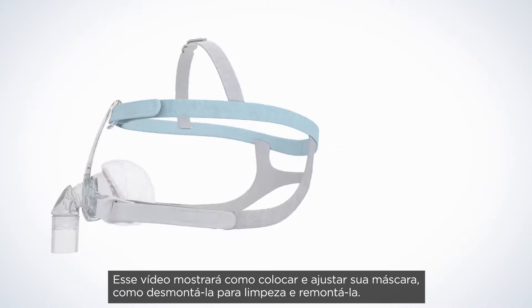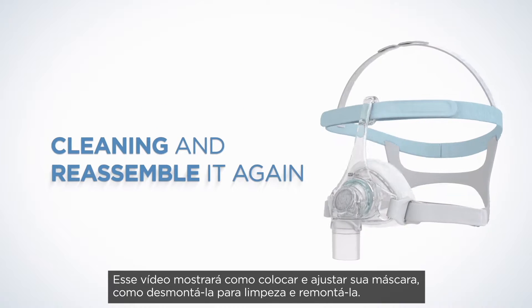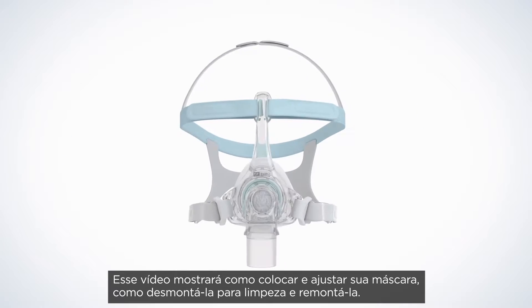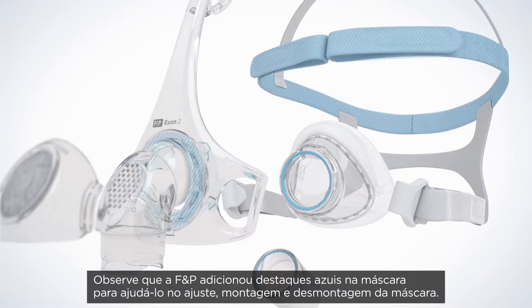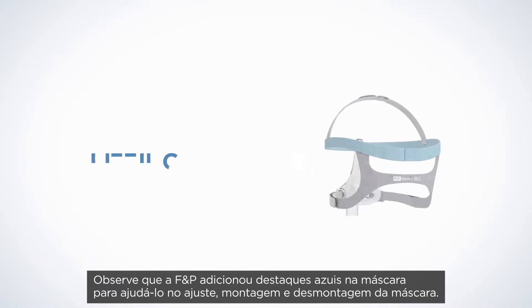This video will show you how to fit your mask, take it apart for cleaning, and reassemble it again. Please note that F&P has added blue color cues into the mask to assist you with fitting, assembly, and disassembly of your mask.